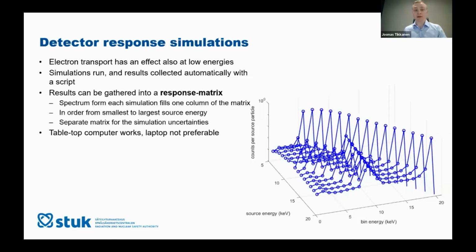And from computational power, these response simulations you can do with a tabletop computer. I would not recommend a laptop. You can do it, but it takes a long time, and also your laptop starts suffering a little bit if you do a lot of these different simulations with it. And of course, a cluster is always nice, so you can run these simulations faster.